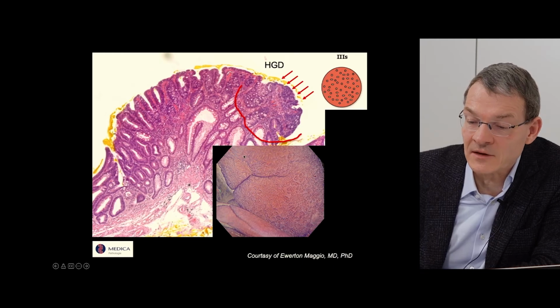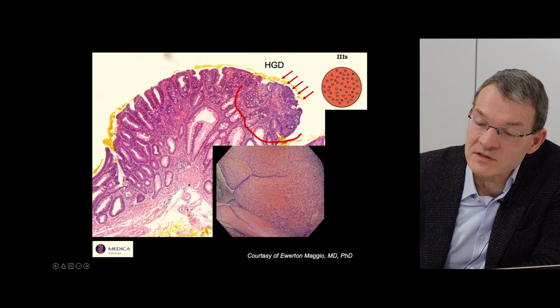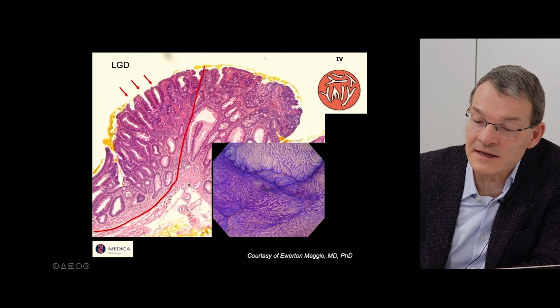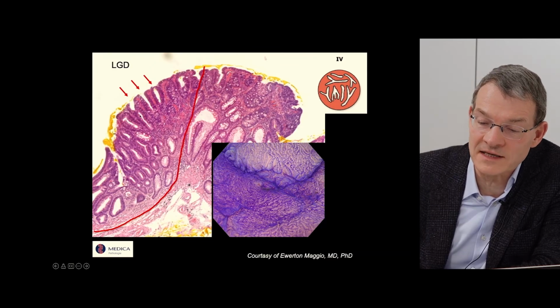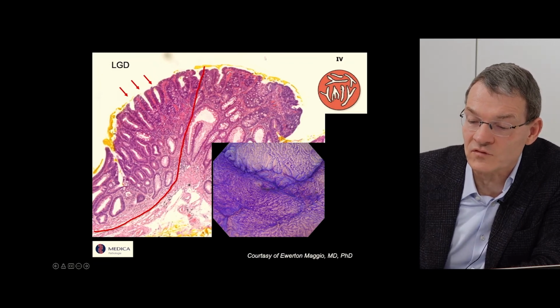And we tried now to compare the histopathological pictures with the imaging, and you will notice here we have these small openings only in the histology. And when we go now to this side, where we have no high-grade dysplasia, you nicely appreciate here the openings of the glands are larger, and this is corresponding to type 4 Kudo.